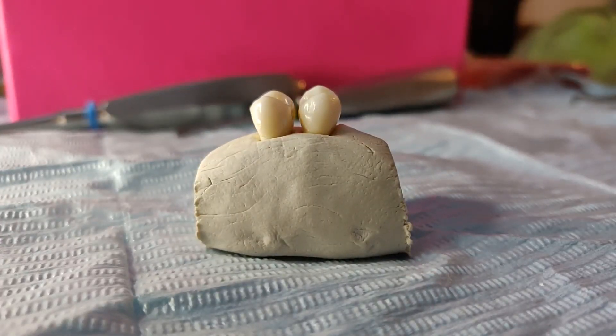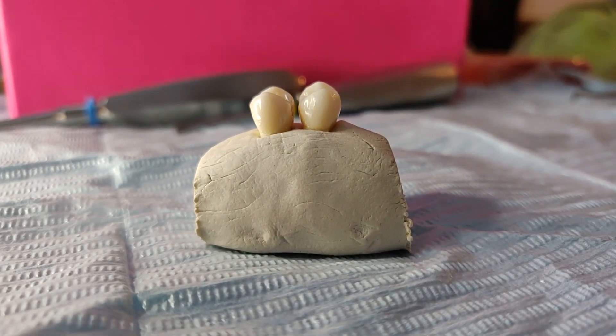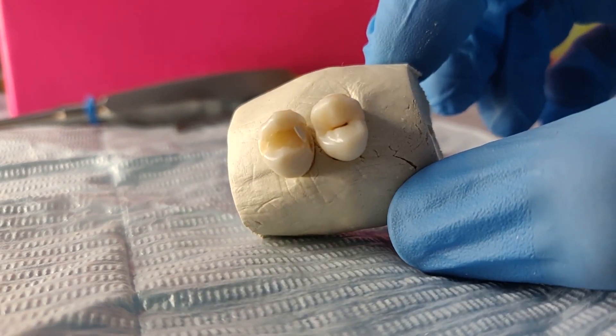Let's imagine that this white dough is the alveolar bone, which is the part of the jaw that holds the teeth. This is how the teeth look inside the alveolar bone.